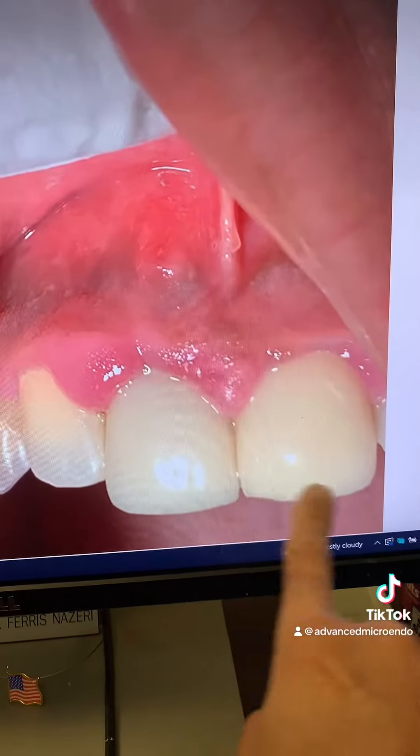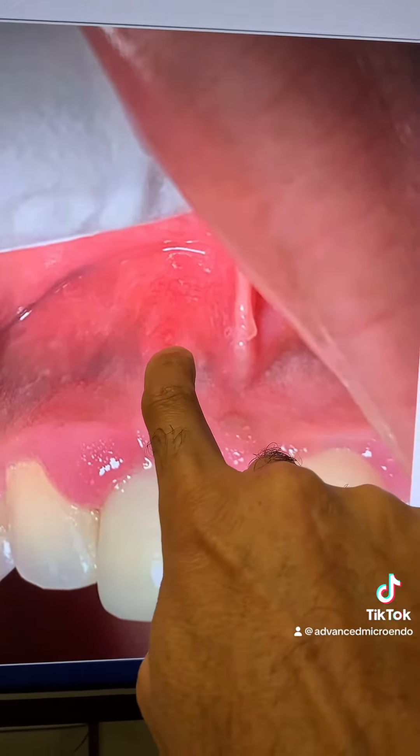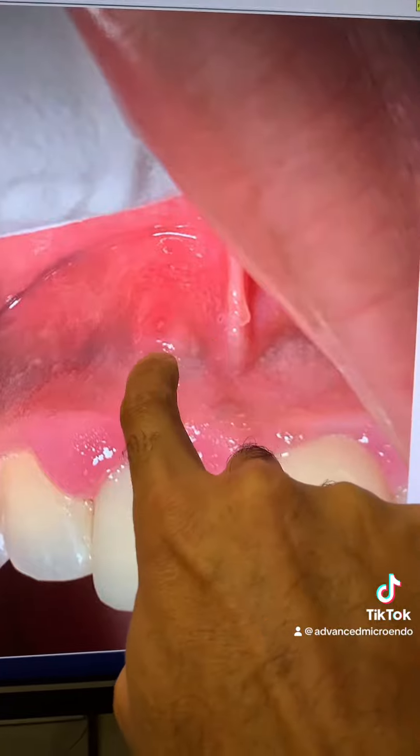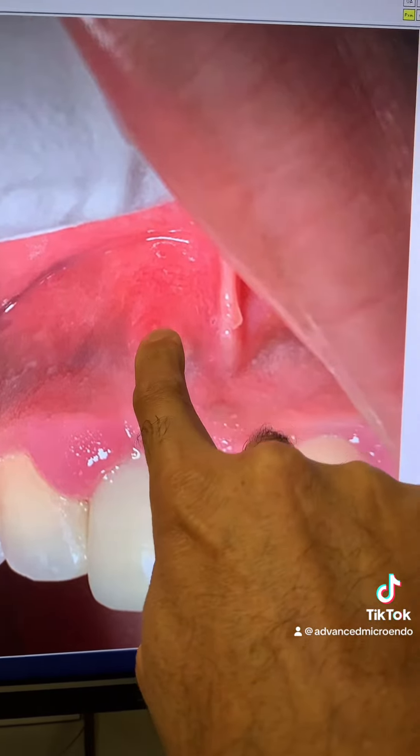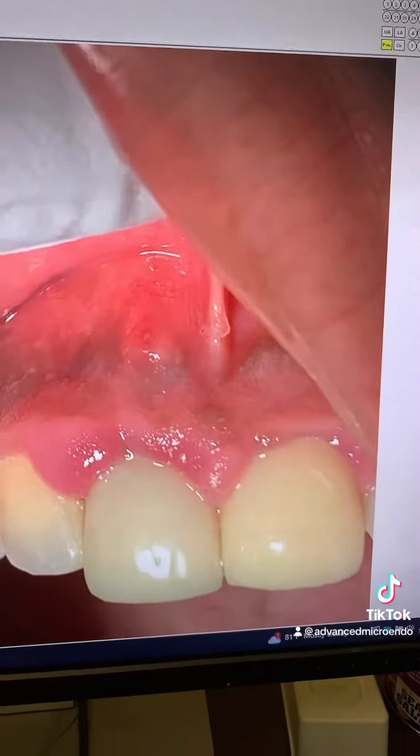This is the tooth right here. And you can see there is a small labial periapical sinus tract associated with tooth number 8 right there.